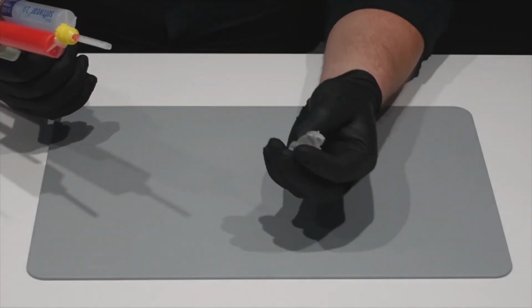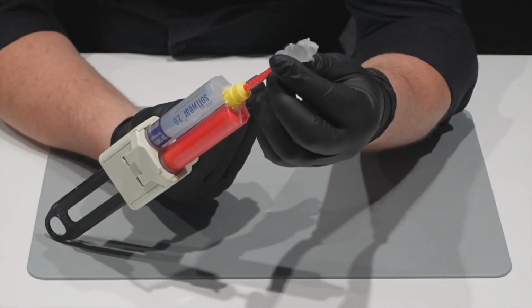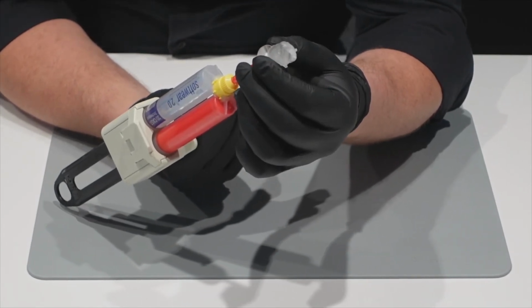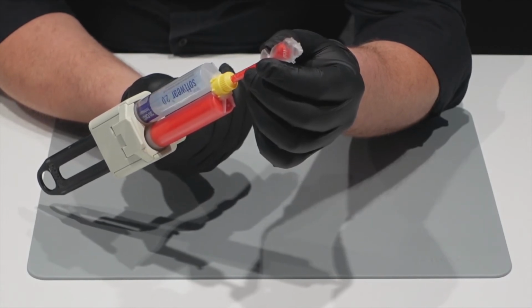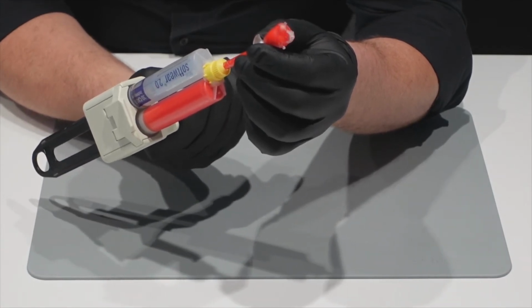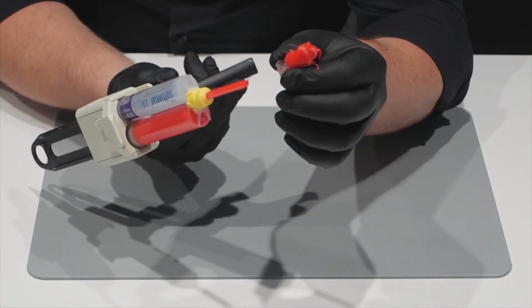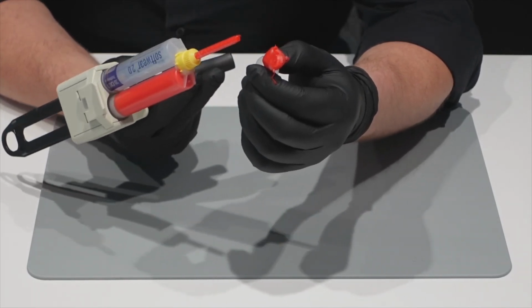Okay, let me show you how to fill the cast forms, nearly the same one like we modeled before. So I fill it up from the bottom in this direction here. And one of the benefits of the Cocoon material is that it is transparent. That means you can see how the silicone goes inside of the form. And now this is absolutely enough if it goes here outside of the spurs. And you can see and you can control there's no air inside. And the rest of small air areas will go away later in the pressure box. I will show you this once more again.